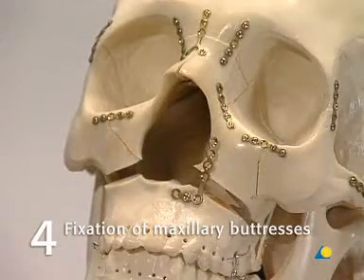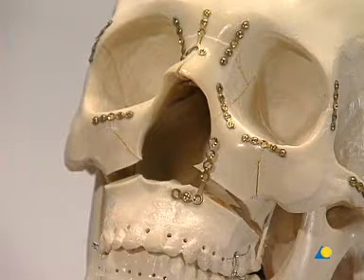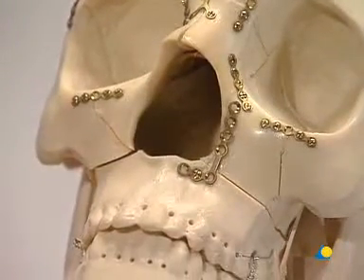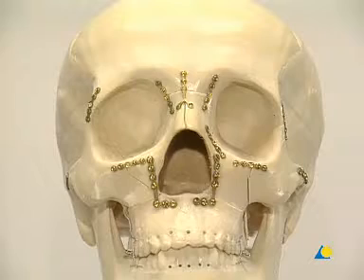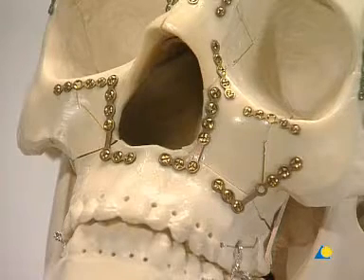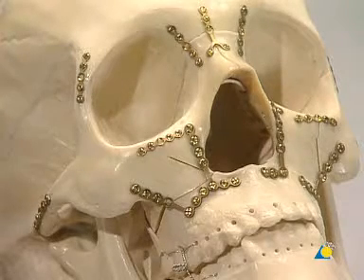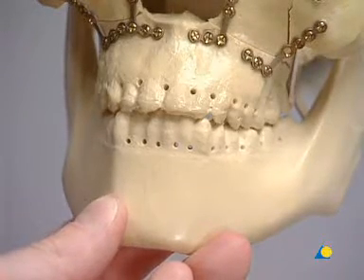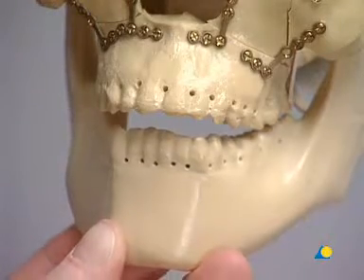Fixation of maxillary buttresses. If the MMF was not applied earlier, it must be applied now. The LeFort 1 fracture is stabilized with 1.5 L plates. The fracture is reduced and fixed with plates along the nasal buttresses. When placing the caudal screws, the tooth roots must be avoided. The fixation is finished with two more plates at the zygomatic maxillary buttresses, where the bone is considerably stronger than it is over the maxillary sinus. Following reduction at the LeFort 1 level, the MMF is removed and the occlusion is checked. This step completes the plating of the basic framework of the midface.